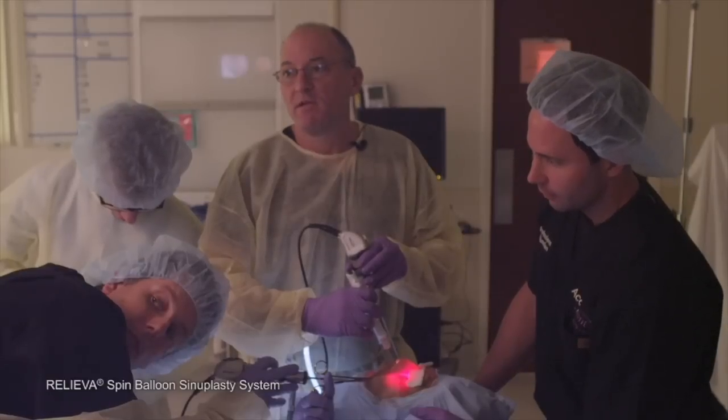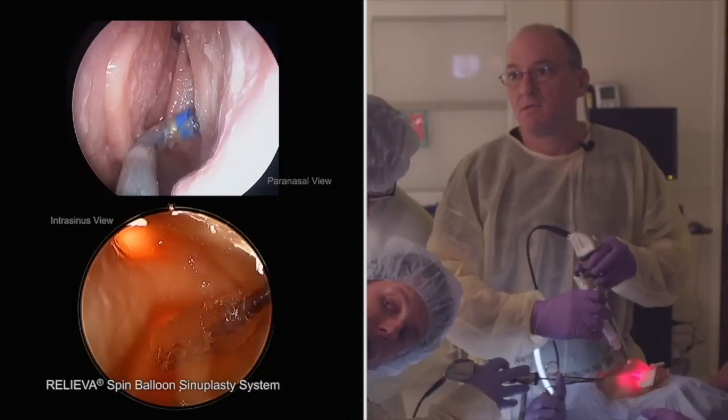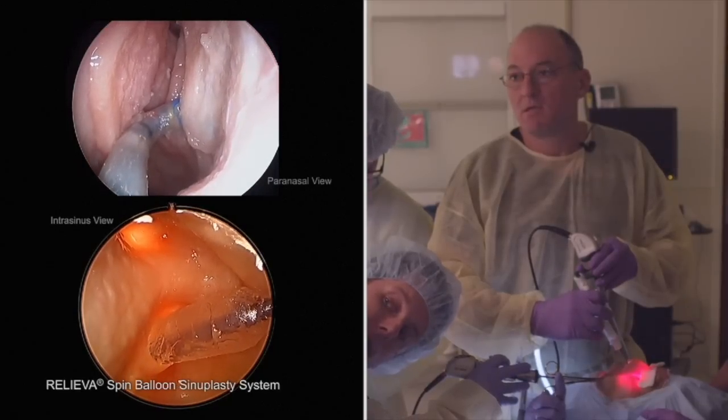Was this a fairly easy one for people to cannulate the maxillary sinus? The first rotation it wasn't — then we went in with the Intelis device and there was a false passage that was created. By advancing the wire and looking at the very fine firefly spinning technique, and the longer length of the wire on the Clarin, I have greater confirmation that I am actually in the sinus, both maxillary and frontal. Comparing the reach of the two devices, the Clarin has potentially and realistically a longer reach to it.